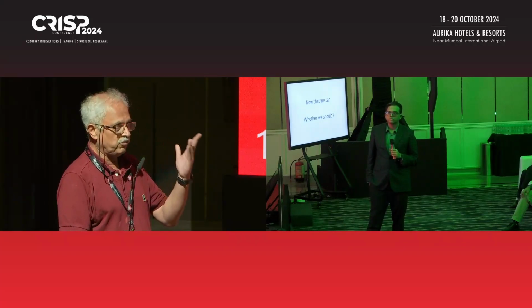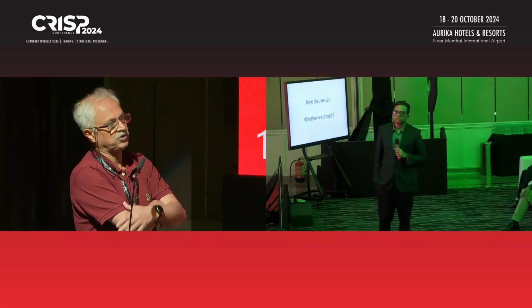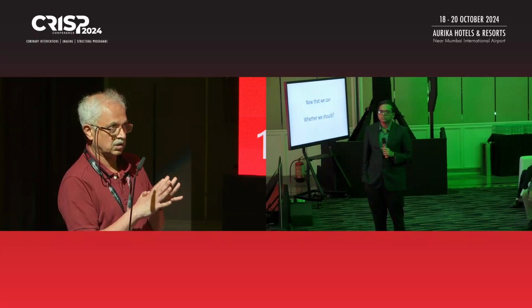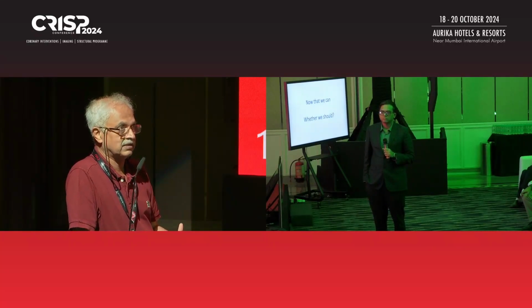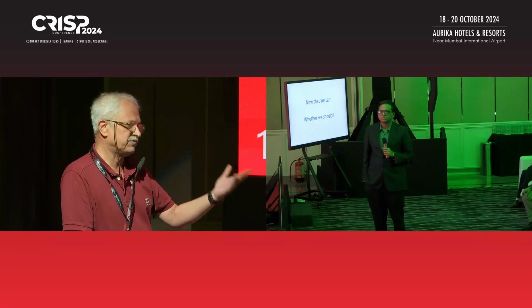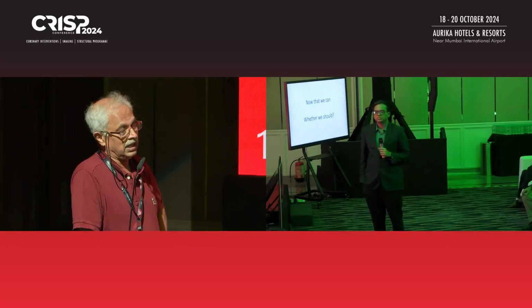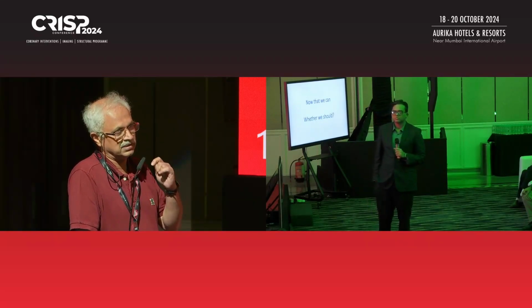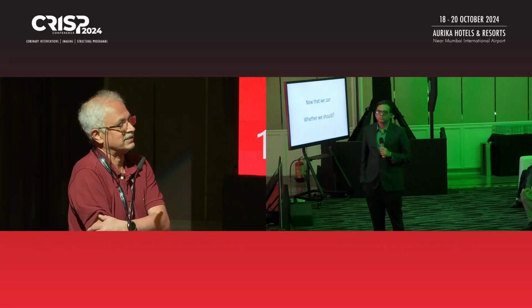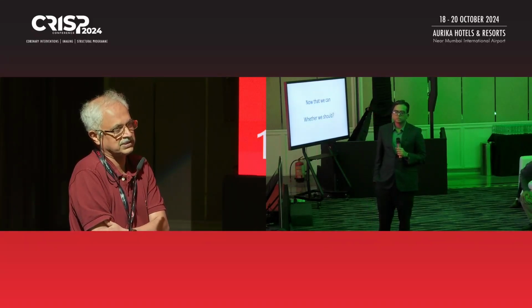Although we were very gung-ho, we have a lot of presentations on large ASDs in small children, and touch wood, we have not had many complications. But the concern about complete heart block is real, as I see more and more cases where we had to actually give up the procedure, bring them back the second time, and we were successful the second time. And that is why my adrenaline levels for closing large ASDs in small children is probably not the same as it was maybe 10 or 12 years back. So these are some of the patients I would probably back out.